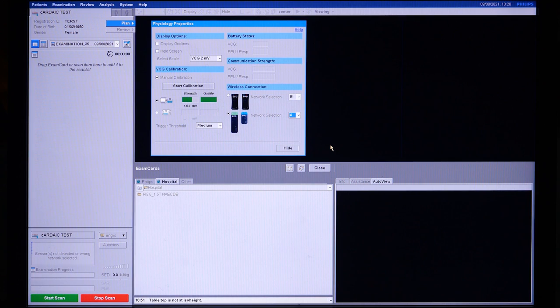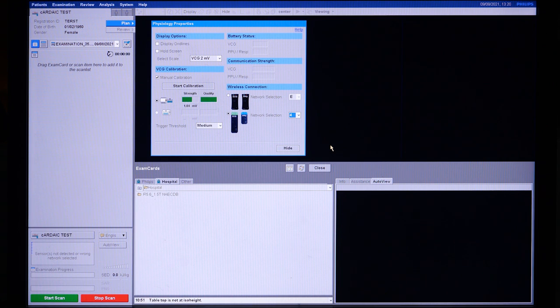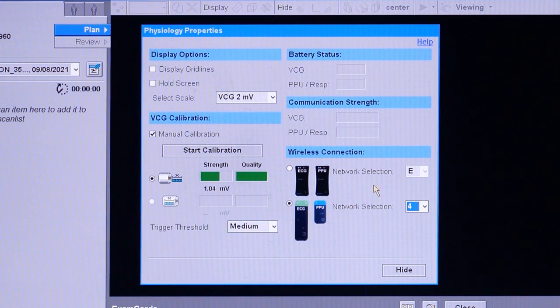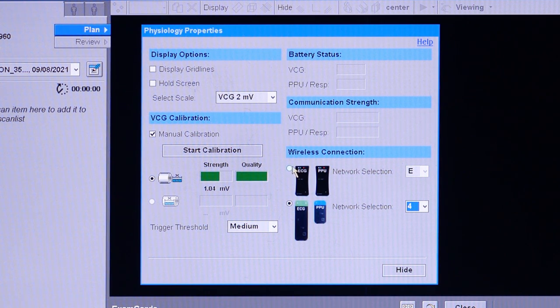To set up for wireless connection gating, confirm that the scanner is communicating with the correct wireless ECG modules. On the Philips scanner, under Physiology Properties, select the wireless modules that will be used based on the pictures provided.